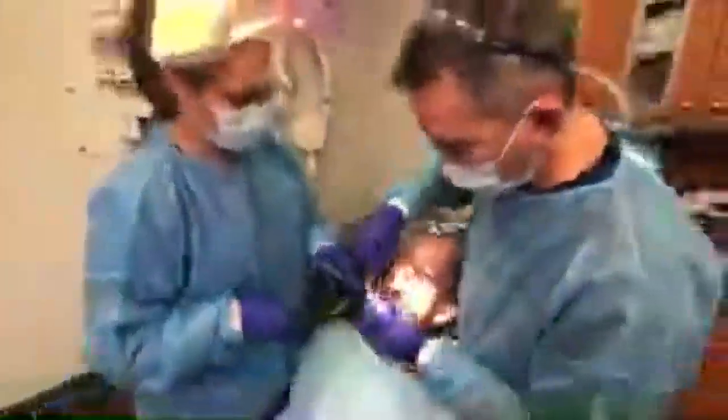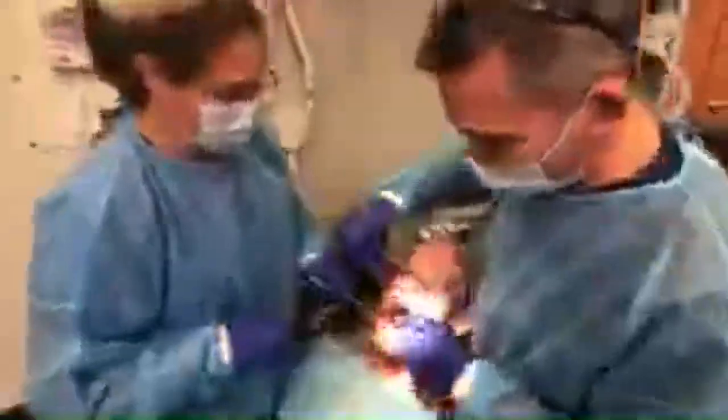You can see it's a very clean procedure — there's no bleeding at all, no discomfort, no jumping around. He's even laughing, but I think that's just gas pain because we gave him pizza before. You're doing awesome and we're like 98% done.